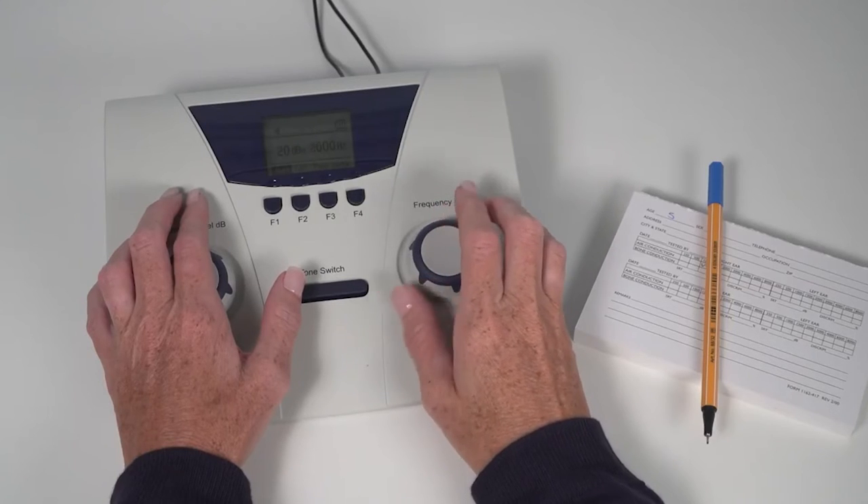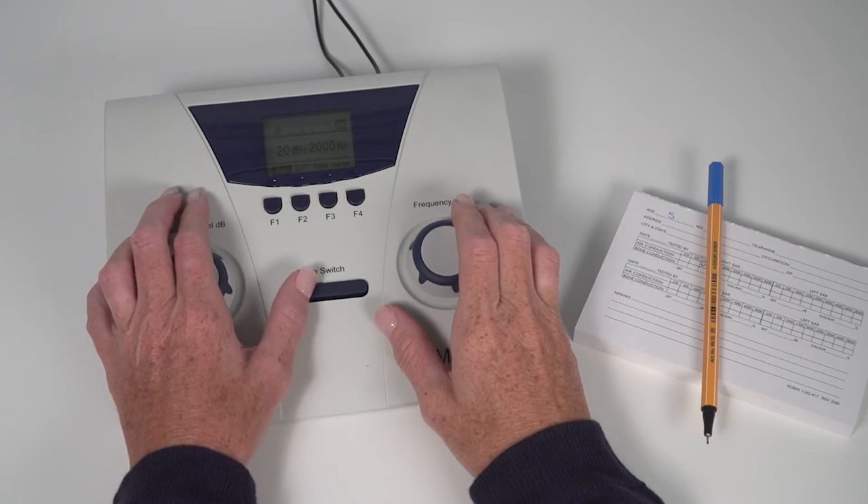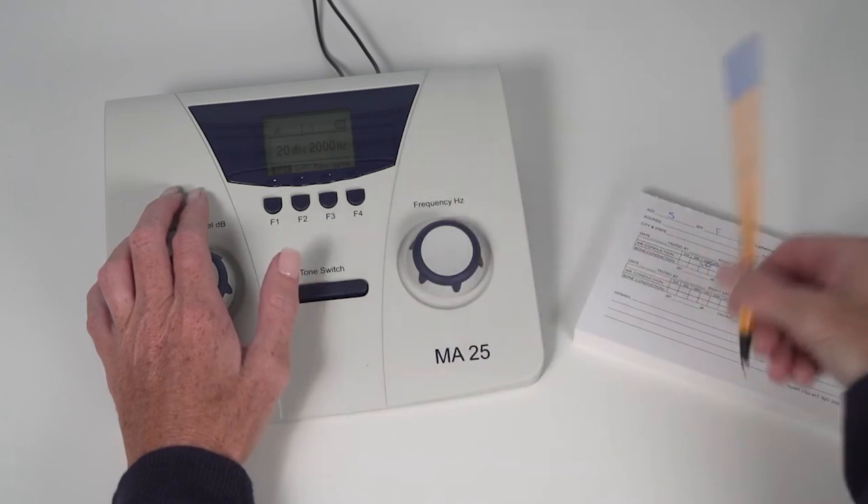Set the frequency to 2000 Hz and repeat tone presentations at the screening level. Document the response. Continue with this method until all frequencies have been tested for both ears.